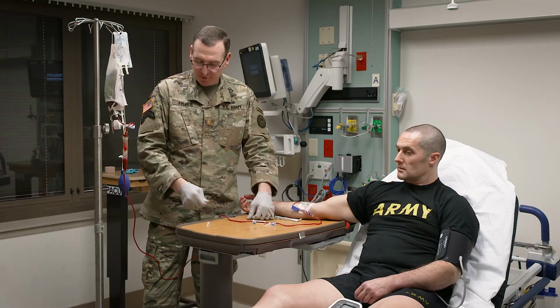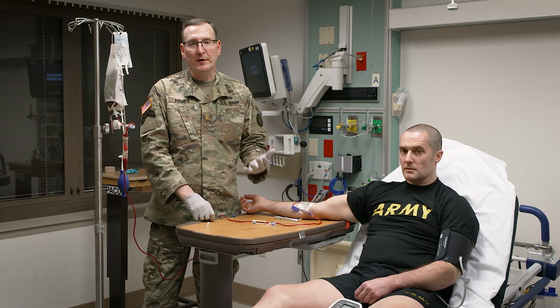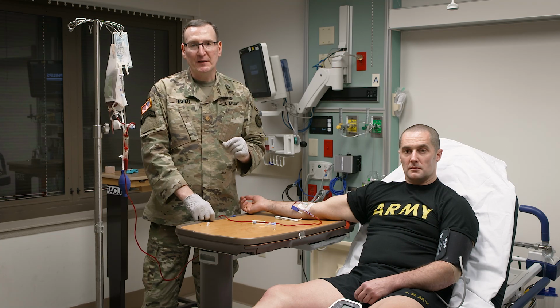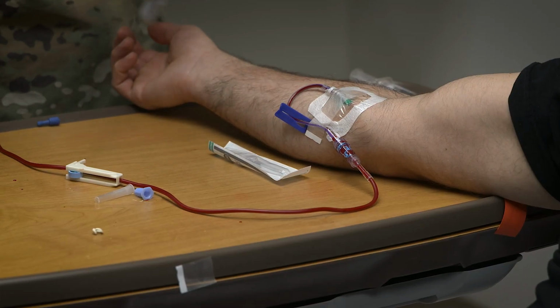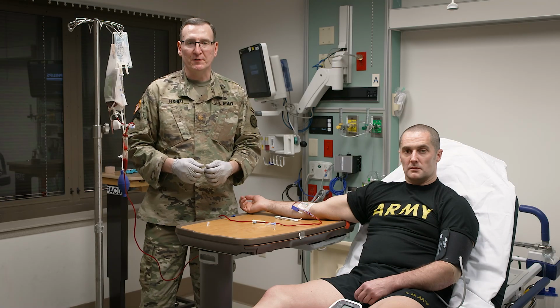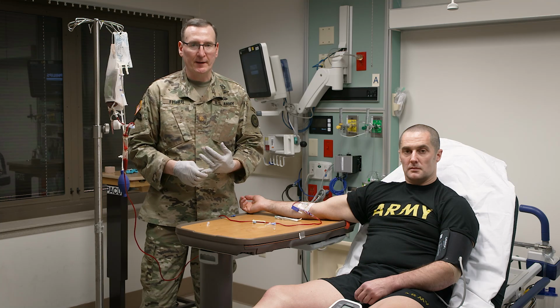Now, as my patient starts to receive the blood, I'm going to watch for a few different things. I worry about some transfusion reactions. The most common transfusion reaction you're going to find is the non-hemolytic febrile transfusion reaction. This is where your patient gets a slight rise in temperature, and this happens because I'm introducing foreign material into the patient. So that's a common thing for it to happen. It can be treated with just simply Tylenol.